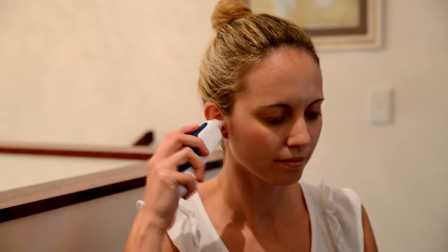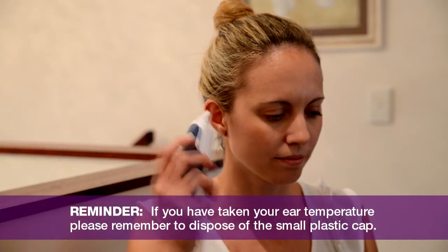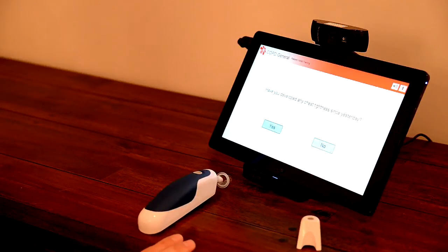Next, gently place the end of the probe into the ear canal. Press and hold the scan button until the thermometer beeps. Wait for the telehealth hub to announce the measurement, then press NEXT on the telehealth hub to continue.